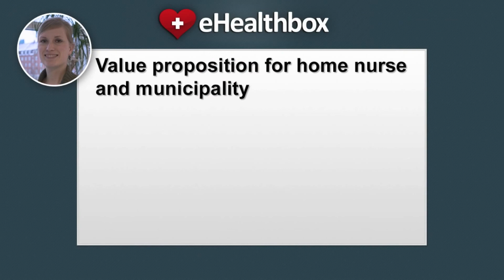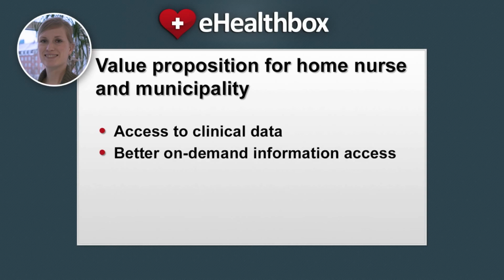Value proposition for the home nurse and the municipality. The eHealth box enables access to clinical data, so that, for example, the home nurse can see if a citizen is struggling to keep the weight and consequently she can change the diet plan. It offers better on-demand information access. Again, the communication features like messaging, video conference, shared data results, etc. relieves the home nurses and the workload in the municipality.